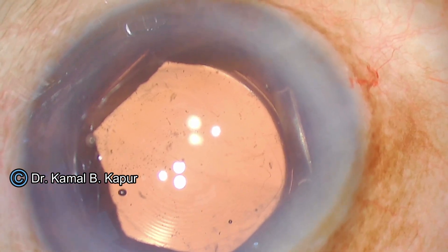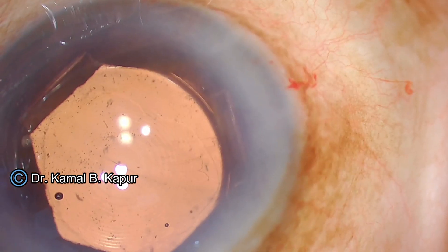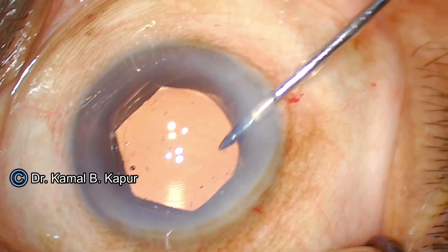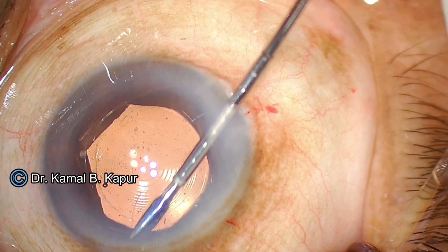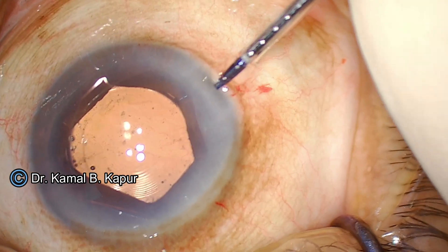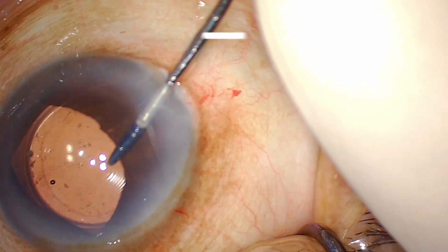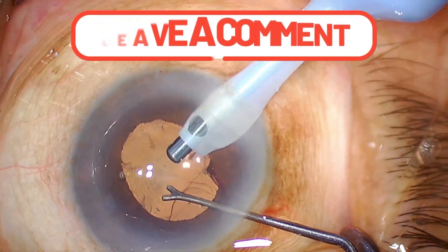What is remaining is an opposite side clear corneal incision to correct the astigmatism — this patient has 0.85 diopters of astigmatism. We remove the B-hex pupil expander by de-enclaving it from one area of the pupil. You can either remove it from the side of the wound and pull it out, or in this case I de-enclaved from two areas and pulled the B-hex pupil expander out. I found the removal of this ring also very easy.